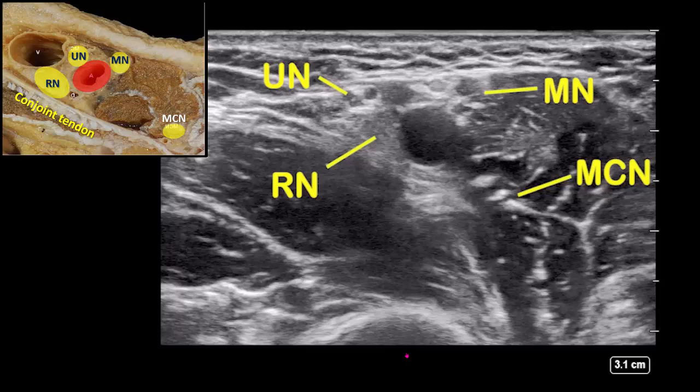The median nerve is always adjacent to the coracobrachialis muscle. The ulnar nerve is always superficial to the radial nerve and posterior to the artery.